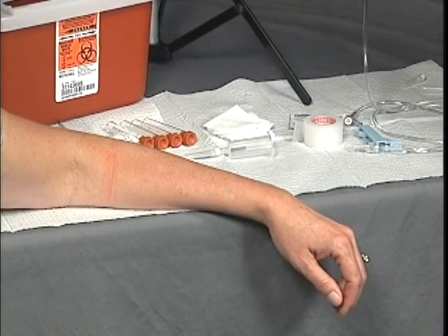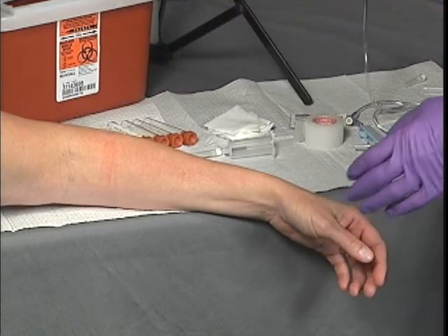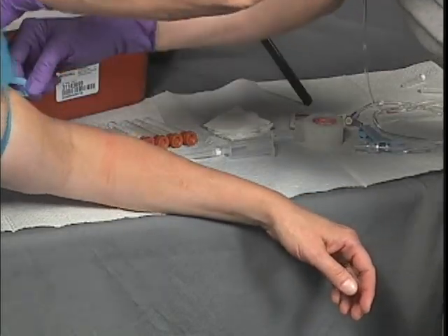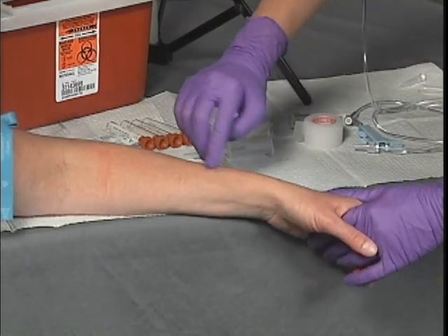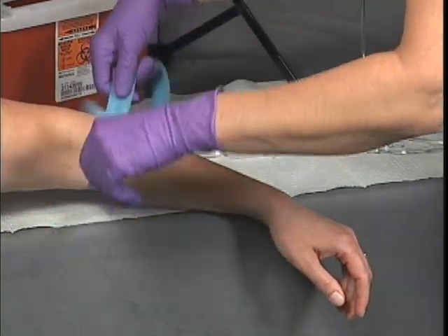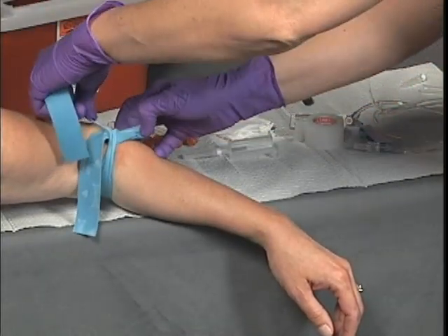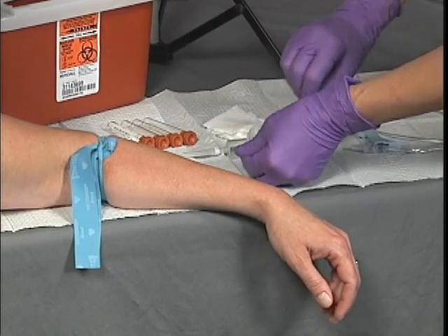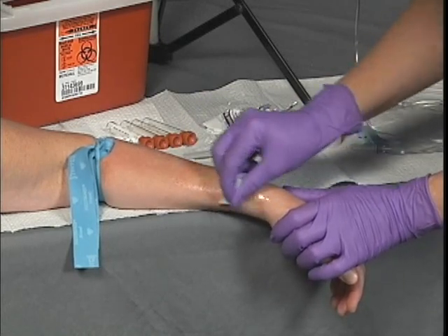Selecting a venipuncture area usually involves the hand, wrist, forearm, or antecubital space. Inspect it for contraindications for venipuncture. Applying a venous tourniquet may help facilitate finding an appropriate site. Reapply the venous tourniquet approximately 4 to 8 inches above the selected area. Cleanse the intended venipuncture site with a suitable antiseptic swab in an outward motion for at least 2 inches, and allow the alcohol to dry for 30 seconds to kill bacteria and minimize discomfort.